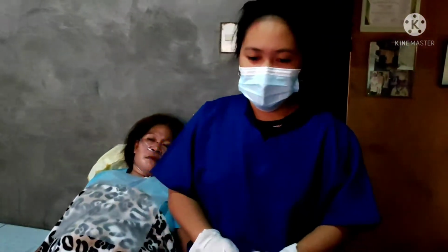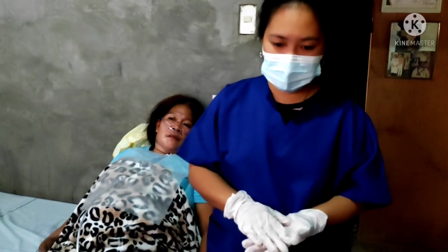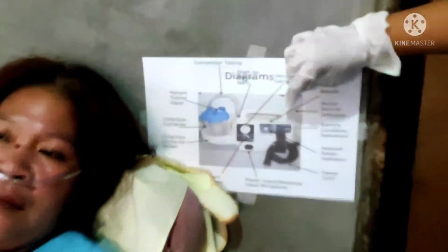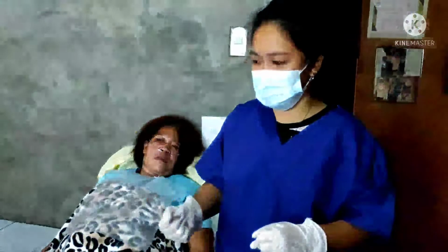With the suction turned off, wash the patient's face. So, turn off the suction machine. And wash her face.